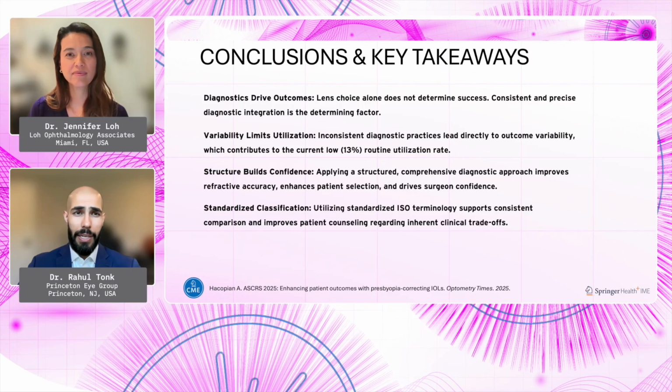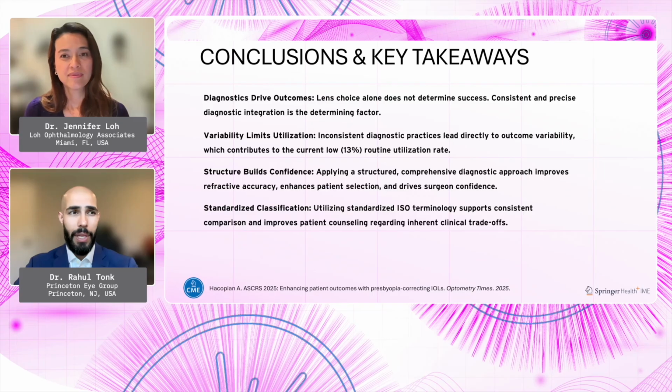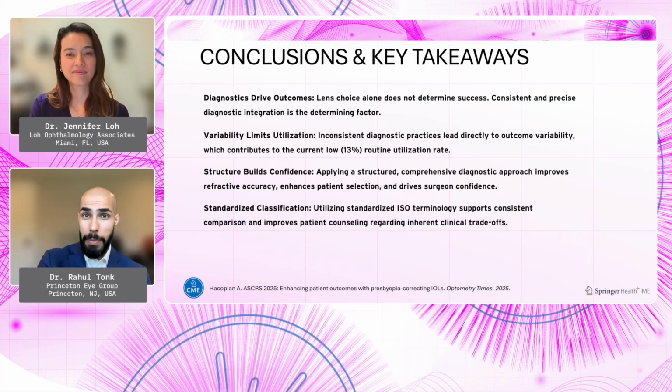Yeah, I think there's a nice workflow that allows us to figure out what is happening with the patient. First, you need a good quality refraction and a good quality look at the patient's ocular surface. And you need to understand, if I put that refraction in front of the patient's eye, are they happy with their vision? And if they're exceptionally happy with the stability of their vision, then you can say that the problem is probably some residual refractive error. And so you might want to have some means of treating that residual refractive error, let's say with glasses or an enhancement eye surgery.